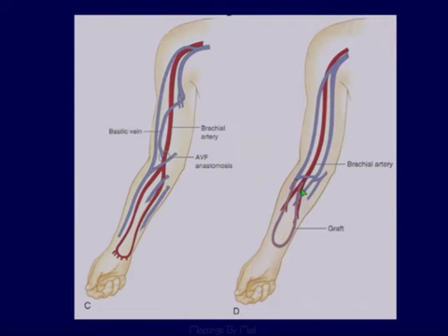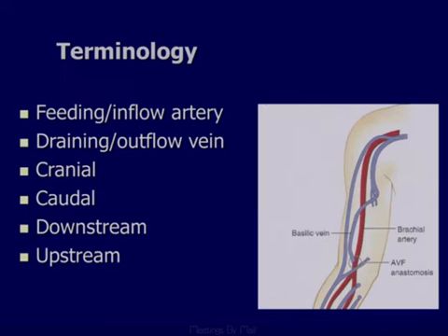Fistula first campaign in the United States obviously pushed away from the use of graft material to autogenous vein. This is one of the favorites that some of the surgeons in Albany use. They use a basilic vein transposition. But I think if we're scanning these things, if they're not our own patients, we've got to get the op note so we can spend the time scanning and not trying to sort out what's hooked to what.